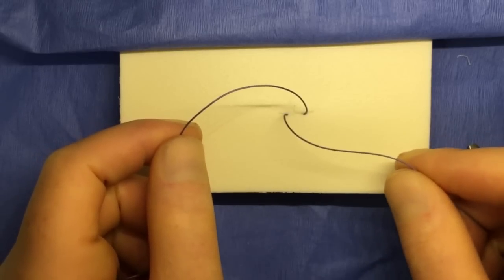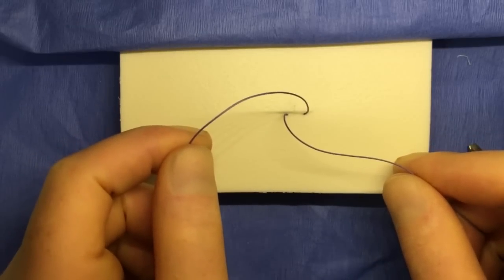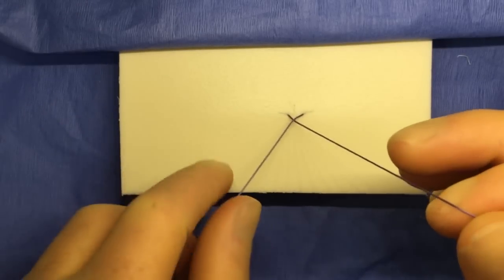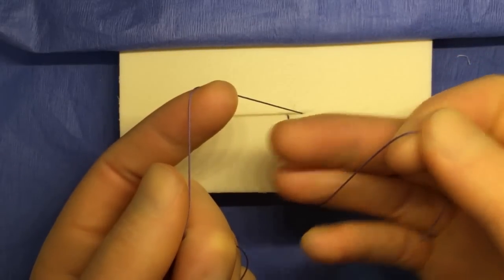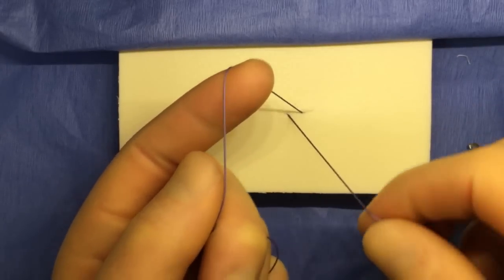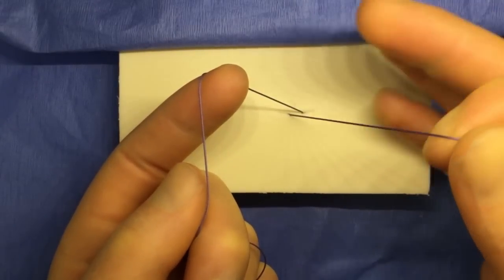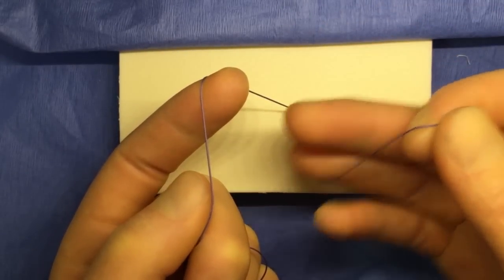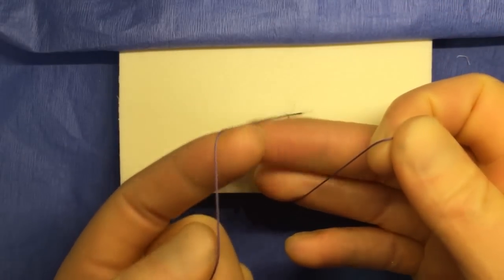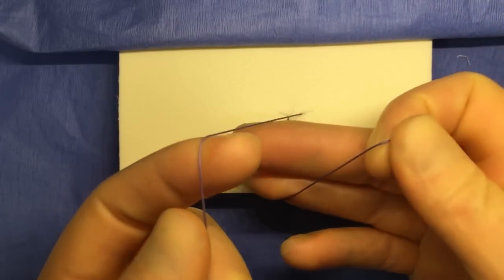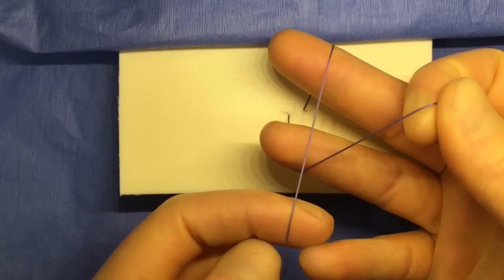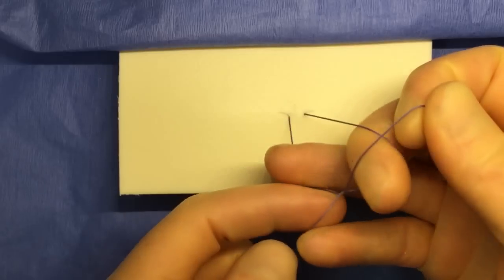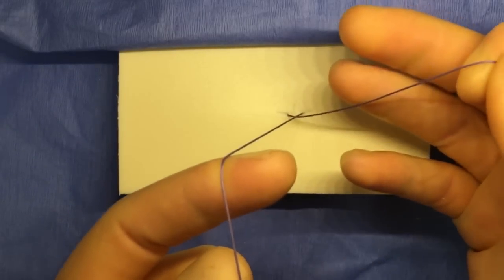So to perform the one-handed surgeon's knot, starting in this position, the lower string in the right hand, the upper string in the left hand, I'll illustrate with two fingers first. I begin the knot using a two-fingered backhand motion with the right hand. This would be the typical portion where I cross over and pull my middle finger through the loop. So that's the first motion.